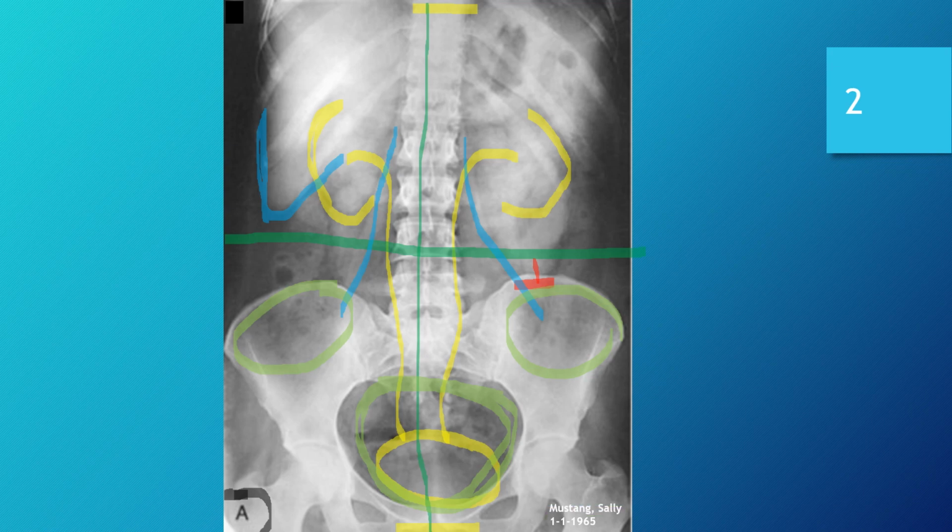We do have, of course, our partial patient information, and that is right here. We have a name and a birthday. We know that we need a medical record number as well to really help us identify that patient, or rather, I should say help the doctor identify that patient correctly and make sure the exam goes with the correct patient. But okay, all right, well, that's our first belly analysis image.